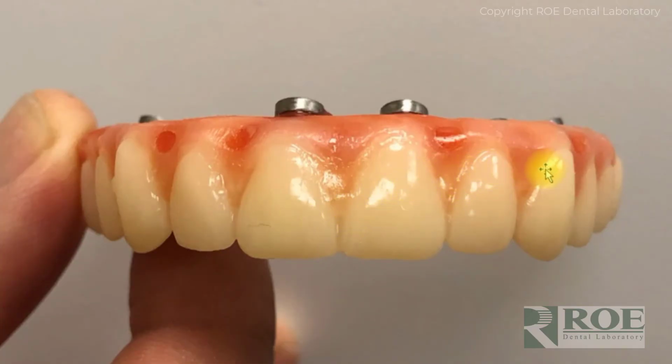Now this picture doesn't really do it justice. I think a little bit of flash really showed these interproximals not looking too good. In the mouth they looked better, but I think that there was probably a little bit too much material and glaze added after. But notice one thing, these injection ports, they're not really necessary. I know some doctors like to use them because they want to put the patient in occlusion when they're picking up, and that makes sense. It's nice to have occlusion refined or at least balanced before you send the patient home.